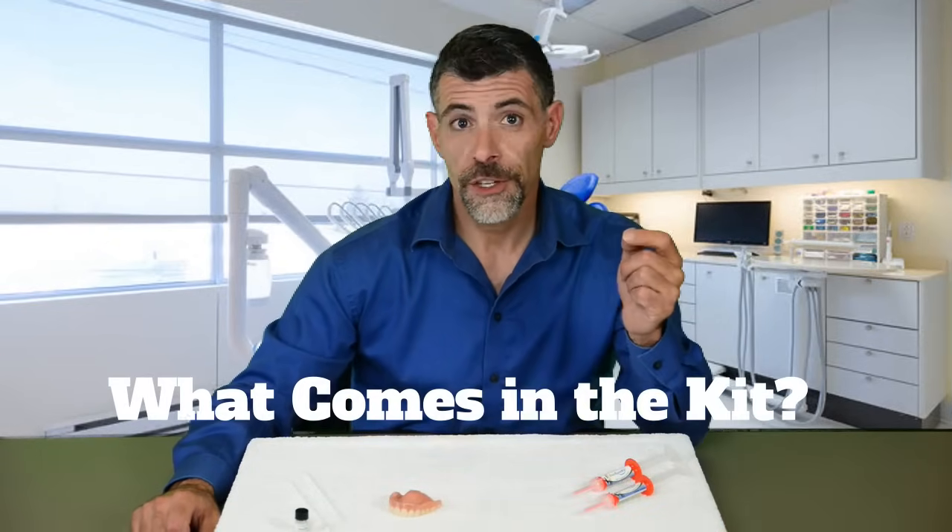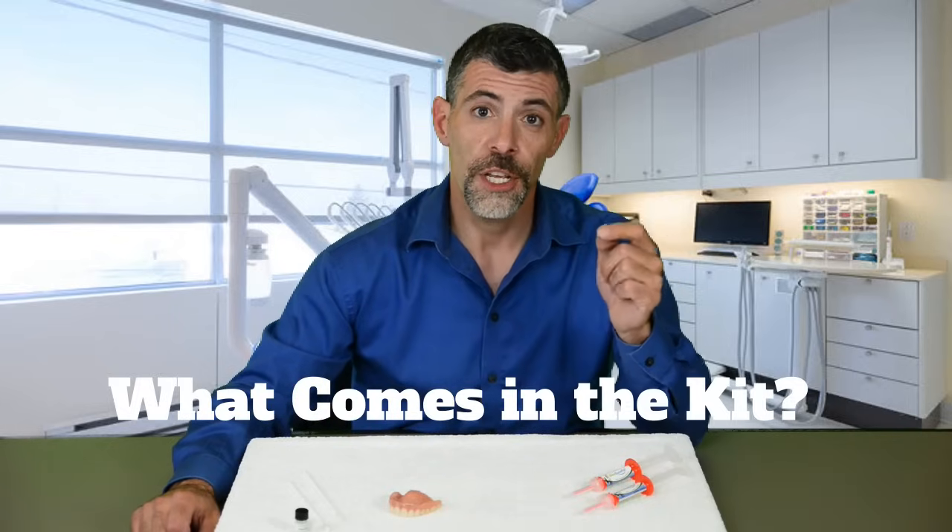Now that you have a better understanding of Denture Fit and what it can do for you, let's go over the contents of our kit. Please understand that one kit is designed for the reline of one denture plate, so if you have uppers and lowers you may need two kits.